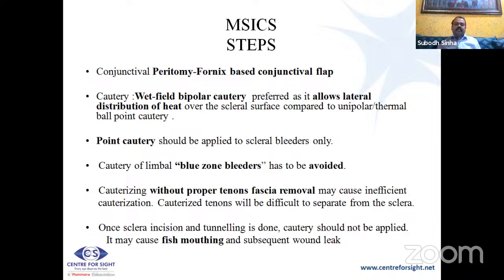Always do cautery after you have removed the Tenon's fascia sufficiently. If you don't do it, then removing it later will be very difficult. Once you have made the scleral incision and tunneling, cautery should not be applied, because if you do that, there will be fish-mouthing and wound leakage, and you will require suturing.